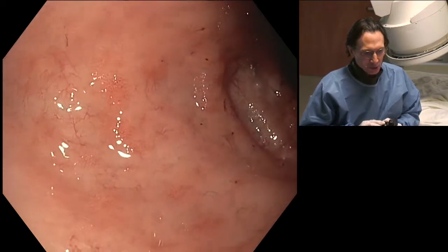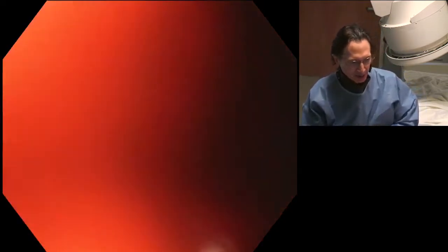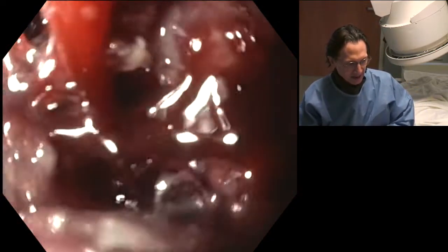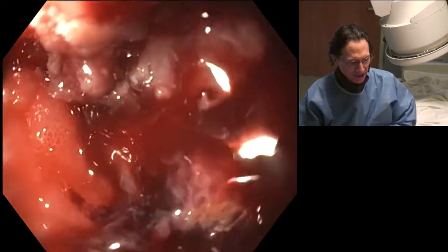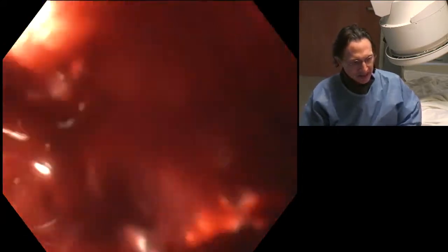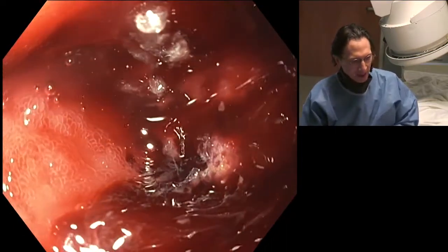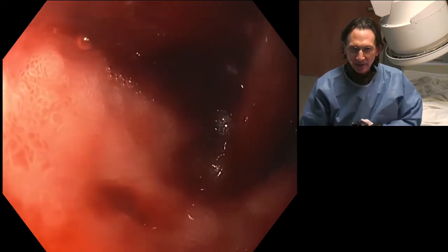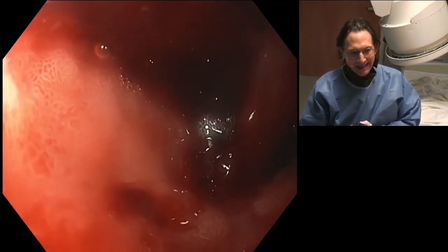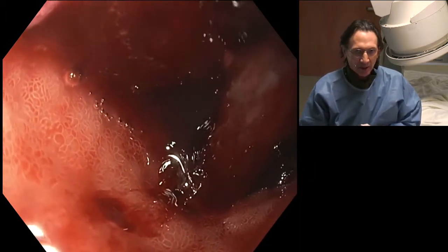There's been some shrinkage of her tumor, but just over 2 years ago, she developed gastric outlet obstruction. And she had stenosis of the duodenum, and a metal stent was placed, a duodenal stent, uncovered, of course. And a year later, she presented back with recurrent gastric outlet obstruction as well as bleeding. And so a second metal stent was placed inside of the first one. And now she presents about a year later again with recurrent gastric outlet obstruction. That's her main complaint. She's losing weight, with nausea and vomiting.